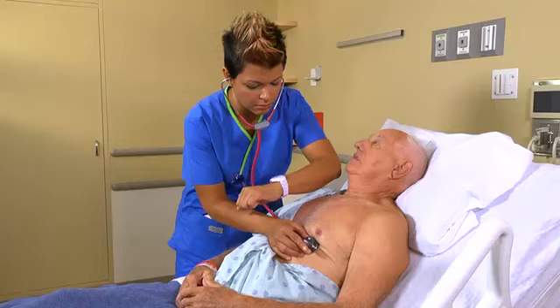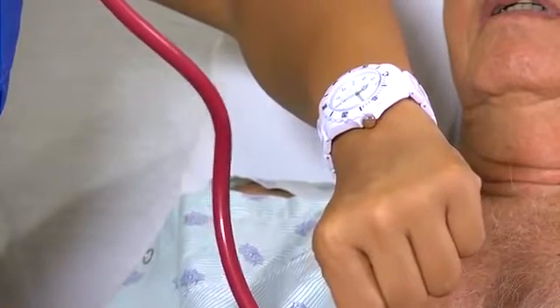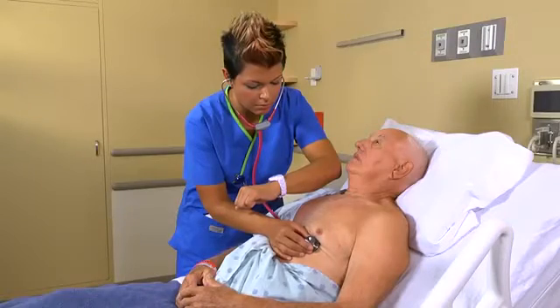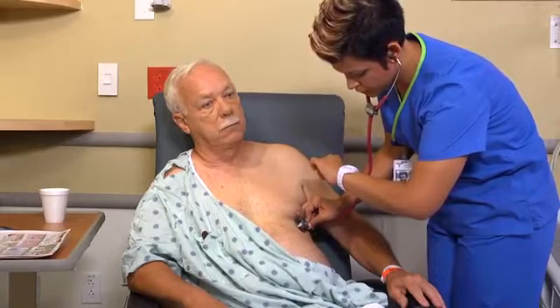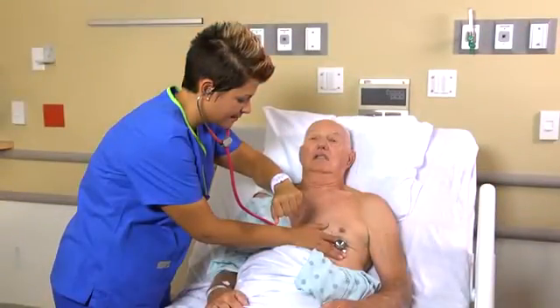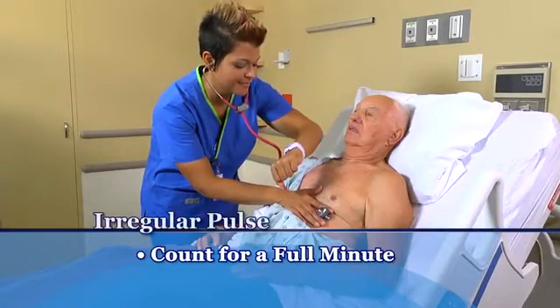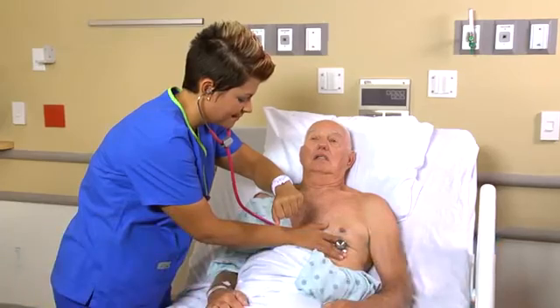Once you can hear S1 and S2 with regularity, look at your watch. When the second hand reaches a number on the dial or the digital display reaches a round number, begin taking the apical pulse, counting the first beat you hear as 1. If the pulse is regular, count the rate for 30 seconds and multiply the total by 2. A normal heart rate ranges from 60 to 100 beats per minute. If the pulse is irregular or the patient takes a cardiovascular drug, count for a full 60 seconds. Also, listen for patterns of irregularity with any dysrhythmia — for example, you might notice that every third beat is skipped.